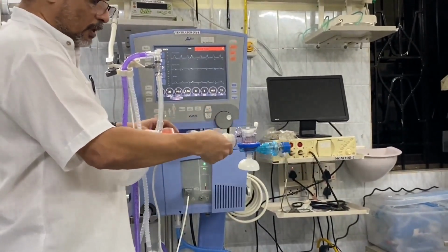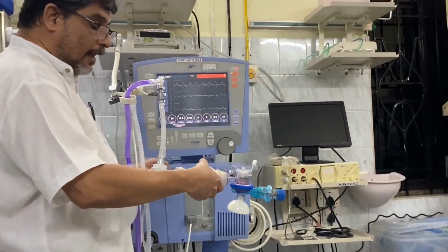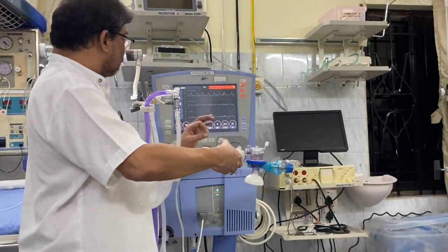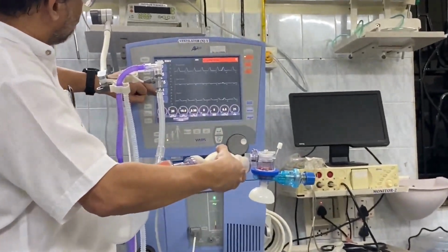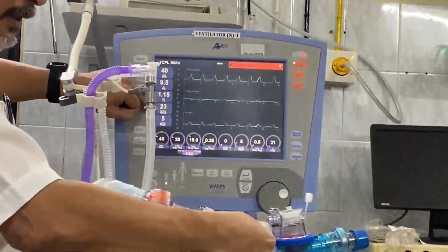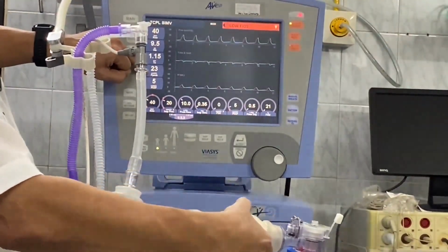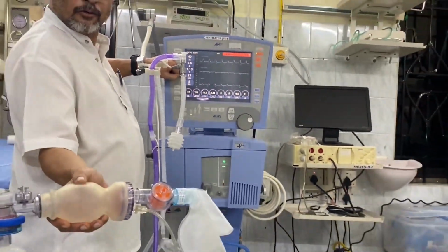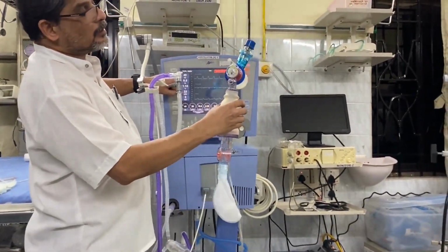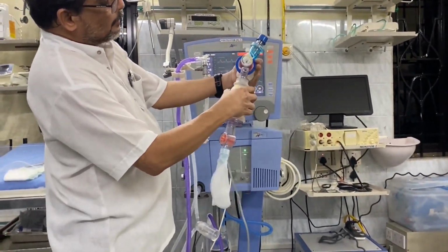So we are done with the rate, the inspiratory time, and the expiratory time. Then the amount of pressure you exert on the bag is called peak inspiratory pressure. This peak is the amount of pressure which you exert on the bag. If you do this, you are putting minimum pressure. If you do this, you are putting more pressure. You can see the thing moving when I am giving the breath.